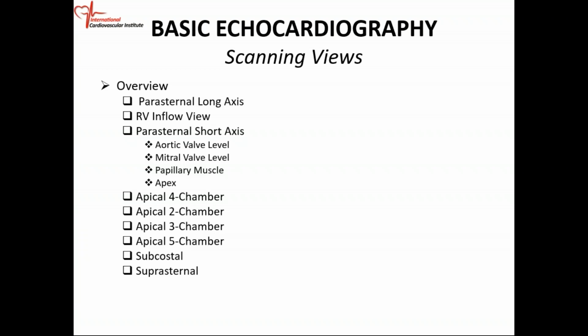So we're going to spend about 30 minutes this morning. We'll probably divide it into about two sessions. We're going to look at what we call the parasternal long axis view, how you position your probe or transducer to get the parasternal long axis view, and what structures you're going to see in it.